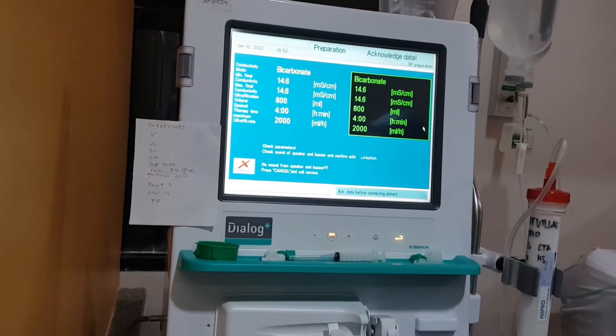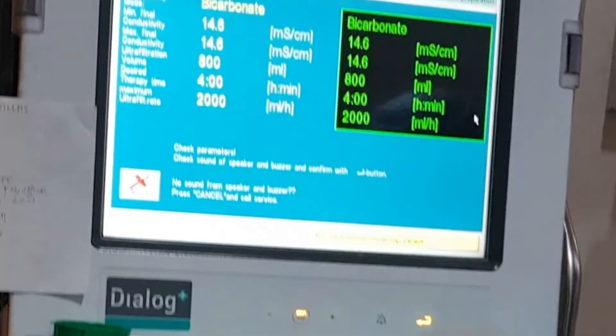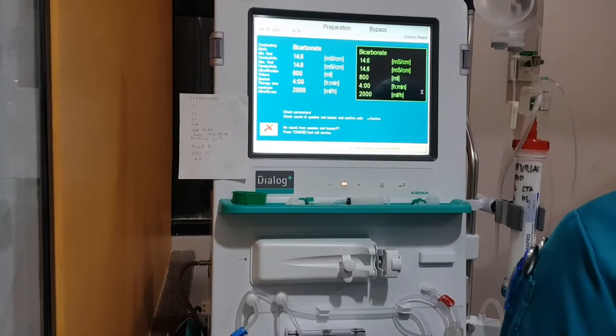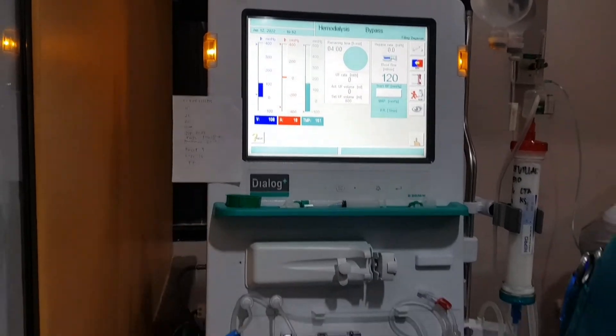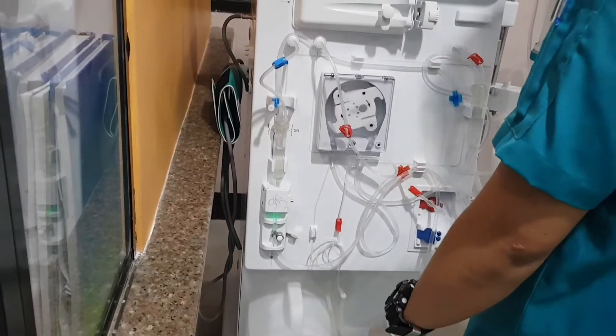Click the connect patient icon. You'll hear two short acoustic signal sounds and the enter button is illuminated. A window appears. Check the patient data and confirm the data input by clicking the illuminated enter button. Deactivate the bypass. Start the blood pump.